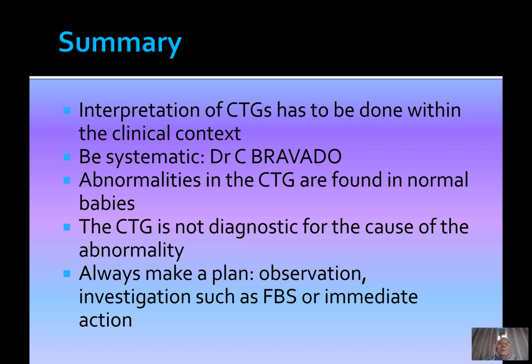So if you have an observation, an investigation, such as an FBS or immediate delivery, or you say, I will come back and have another look at this patient and at her CTG after 15 minutes, to see how it goes on. So always make a plan when you review a patient on the labor ward.